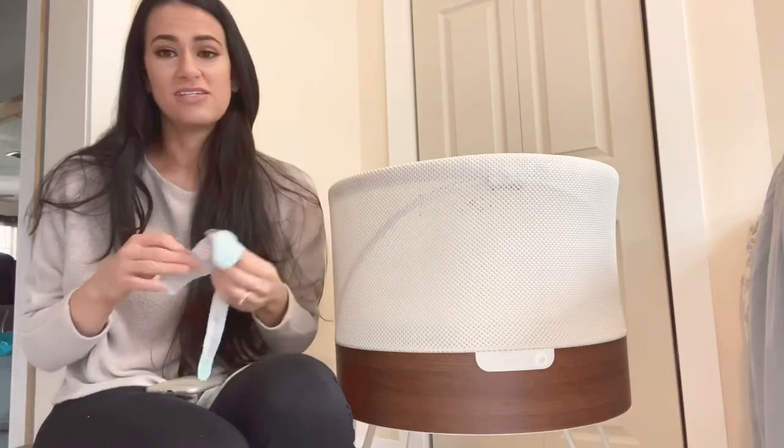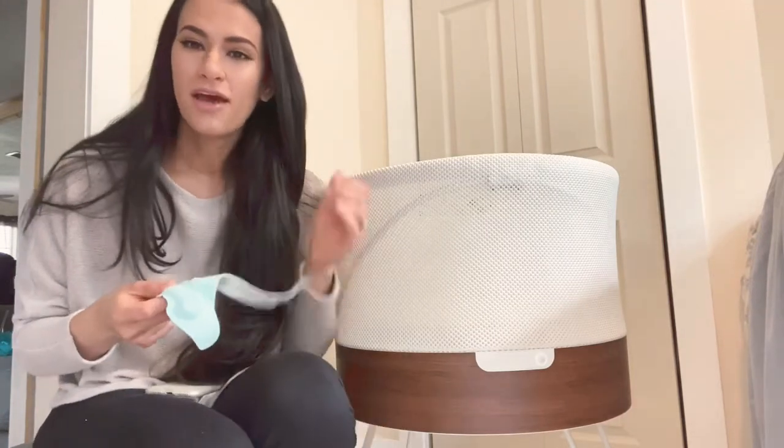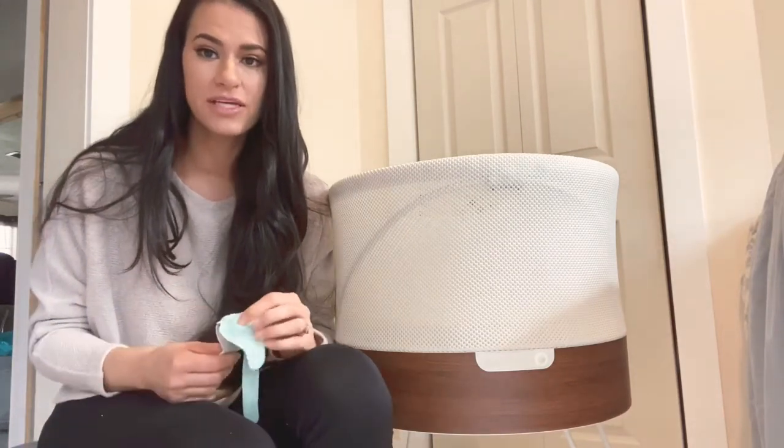I use it along with the Snoo because I like to be triple safe with my babies. So I'm going to show you how to put it on and show you the screen in the app. It tracks their oxygen and their heart rate and it alerts you — it alerts your phone and it alerts the base. It'll go off to let you know if there's been a drop.